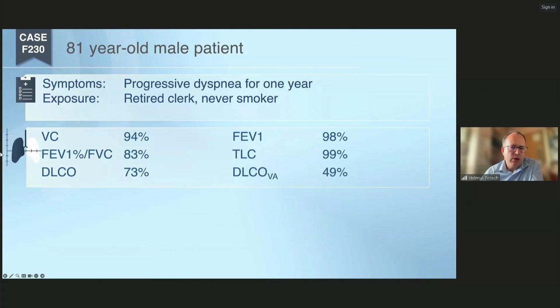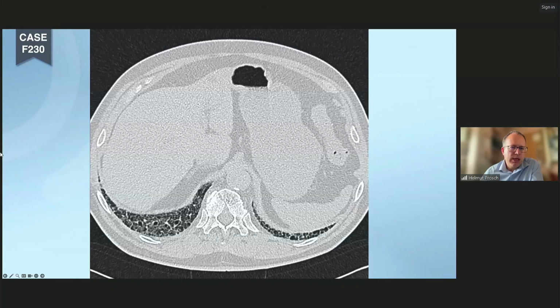And if I click you through these pictures, you will appreciate already down here these reticular abnormalities, the crisscrossing lines. And you see here these rings. These rings correspond to dilated airways. And here in the periphery, you should not see any airways. If you see them, it's either the bronchial walls that are thick or they are dilated, as in this case, that's traction bronchiectasis. So I know already, looking just at this picture, that there's a lung fibrosis.